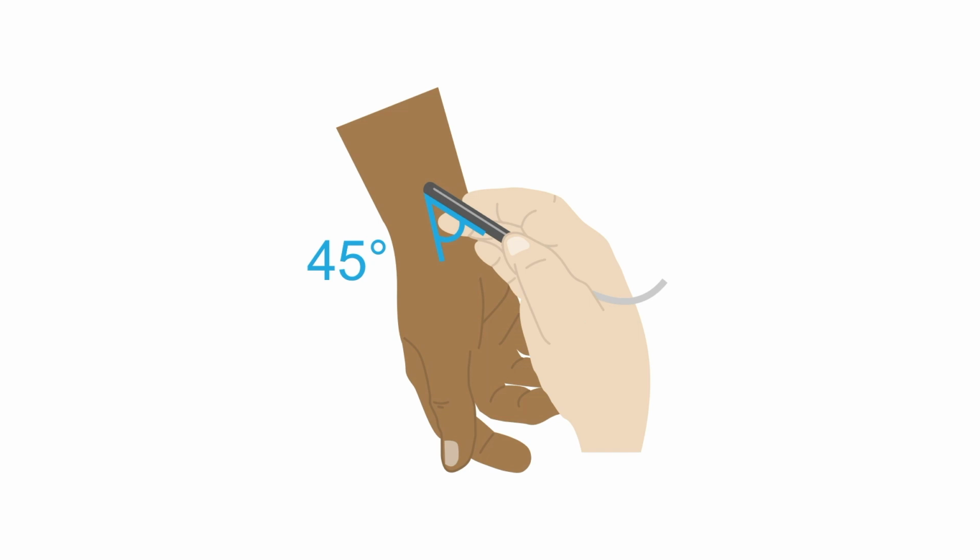Balance your wrist or ring and pinky fingers on the patient's arm or bed to keep a steady hand. Pump up the cuff 20 millimeters of mercury above when you hear the last arterial beat from the Doppler pen. Slowly release the pressure from the cuff and record the pressure at which the first arterial beat returns, which is the systolic pressure.